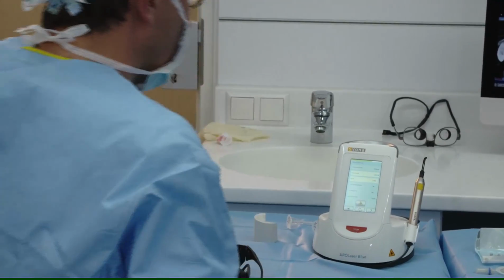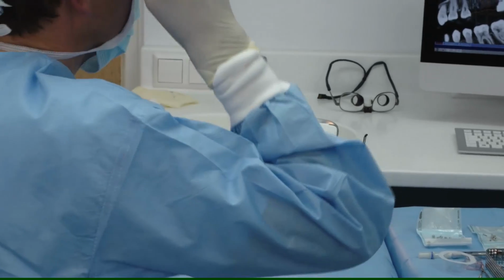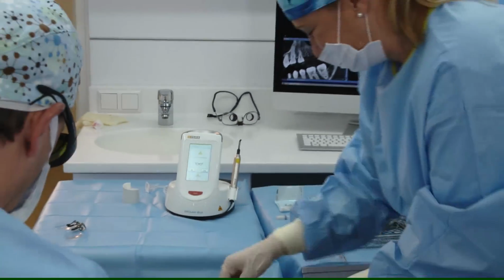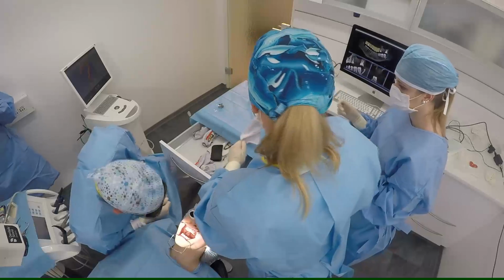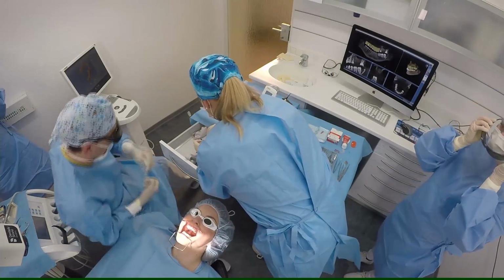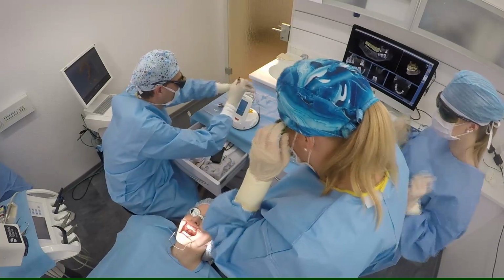We have different modes. We can either use it for cutting with 445 nanometer or for gingivectomy. When we are using this mode, we have 2 watt. It's the blue diode we are using.